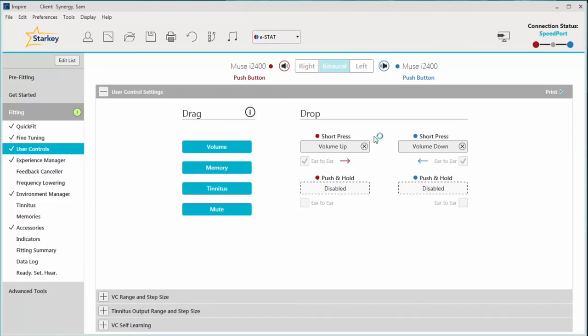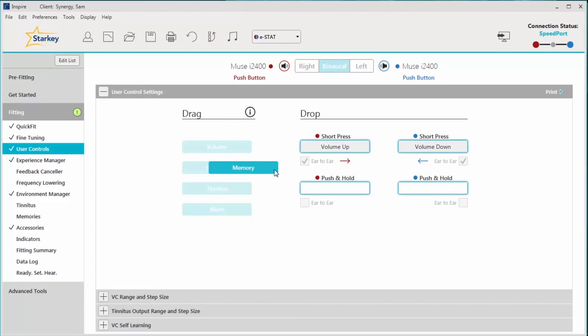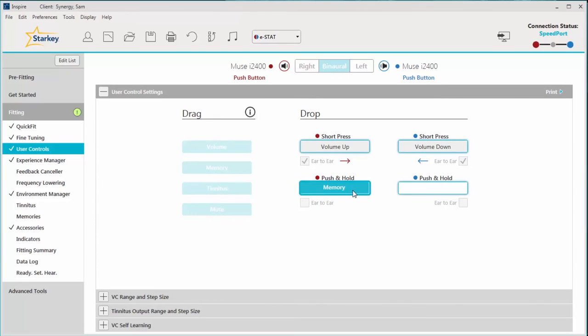In addition to the aids controlling volume, we can also give our patients access to the memories you may have set for them. Click on memory and place it in any of the highlighted gestures. For this patient, I'm going to make the memory access a push and hold on the right aid.